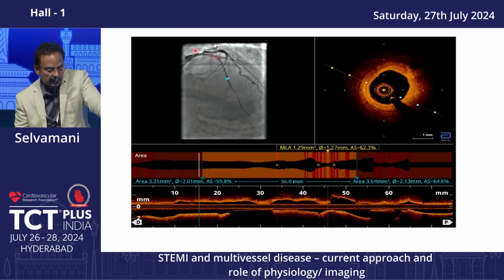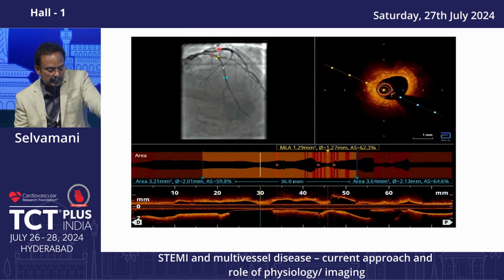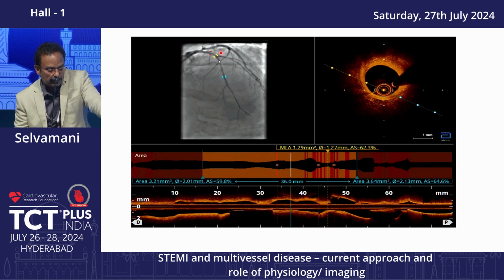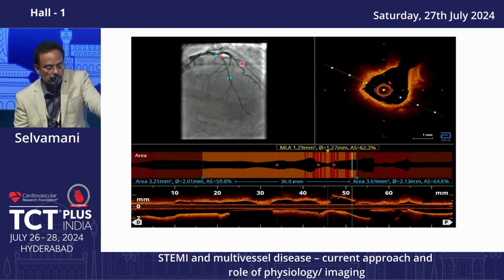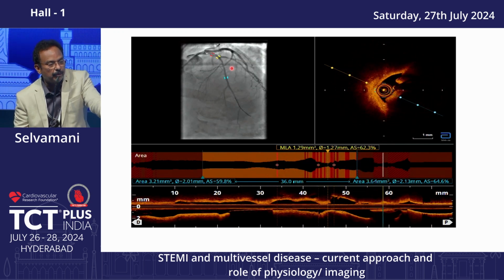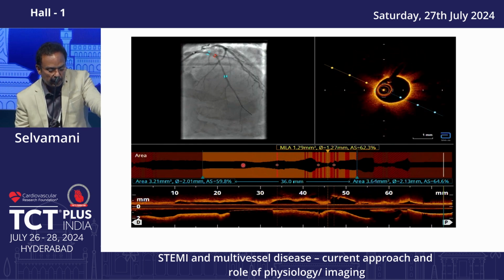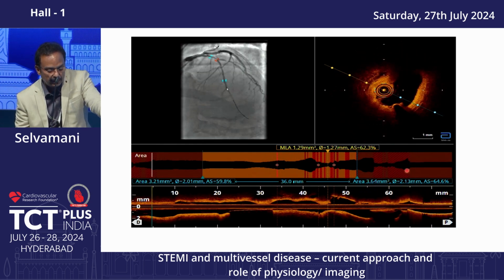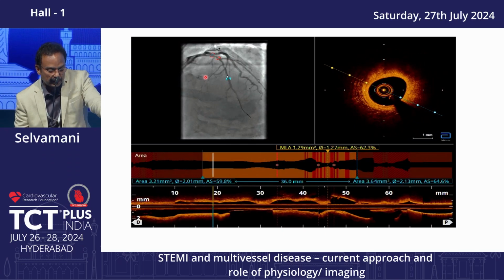If you treat this patient anatomically, it is a reflex that most of my friends put the balloon there at the tightest spot and dilate. The moment you do that, you get slow flow and you have problems. Instead, you do an imaging there, and you clearly know what is inside this vessel. Probably this area has a fibrotic lesion here.